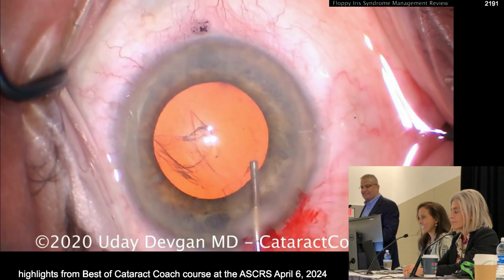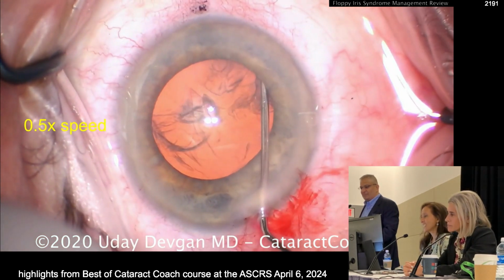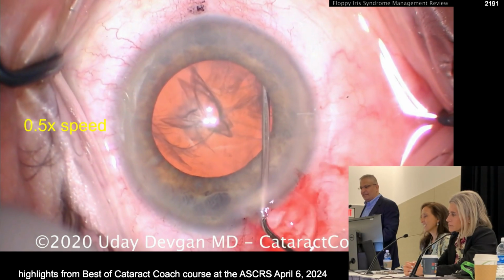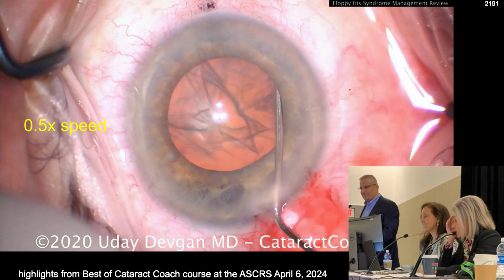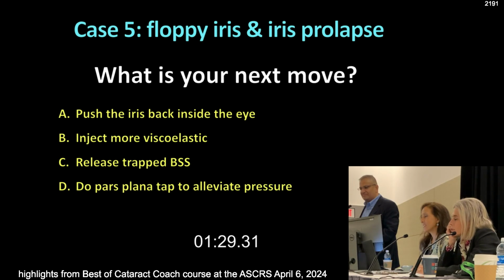So here you go. Here's a case of some iris prolapse. Watch what happens here. So some hydrodissection, fluid going in. Oh, you can see viscoelastic is coming out. Here it comes. What's going to happen to that iris? I don't blot the lens down. Oh, God. So what's your next move?